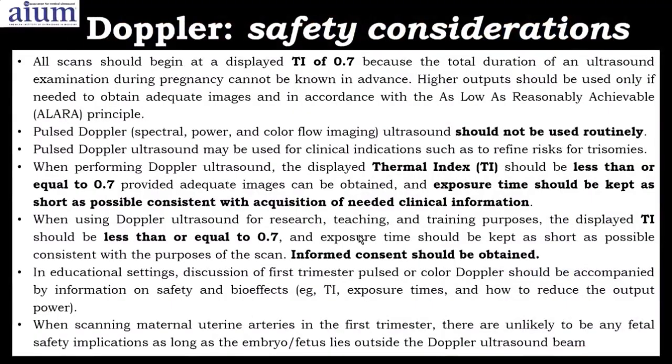There is a lot of anxiety about using color Doppler in the United States, in particular in the first trimester.